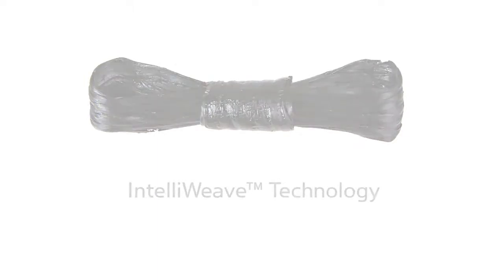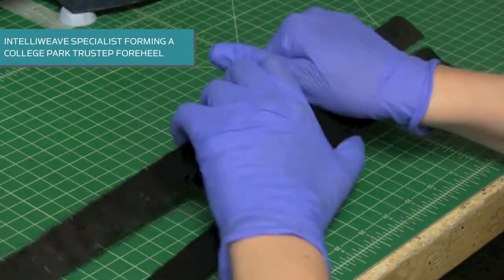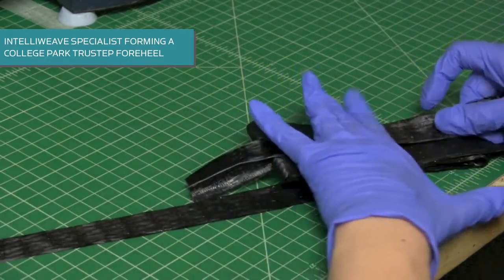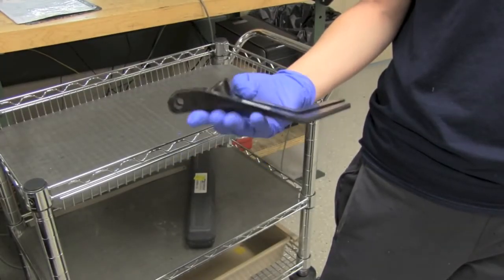The College Park IntelliWeave composite technology is a proprietary process developed to bring the maximum amount of strength and flexibility to a prosthetic foot. Each composite is individually woven by hand in a precise engineered pattern, allowing every fiber to be placed exactly where needed for ultimate durability and precision gate matching.